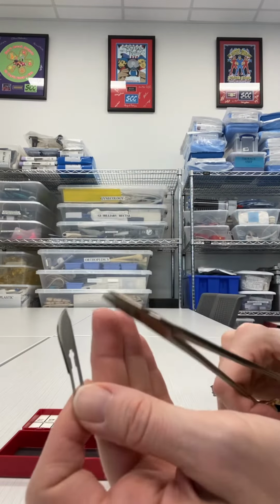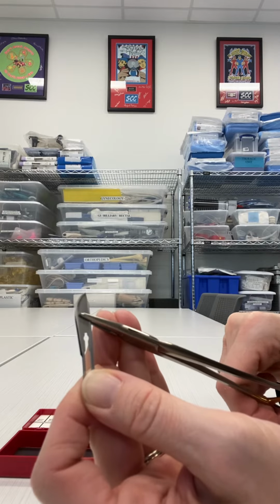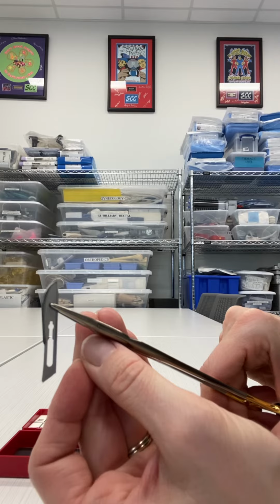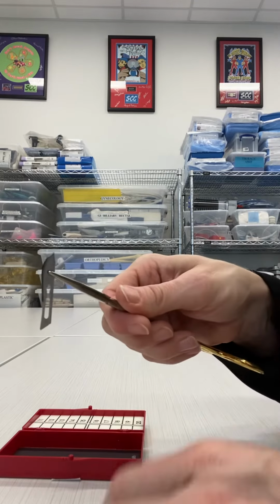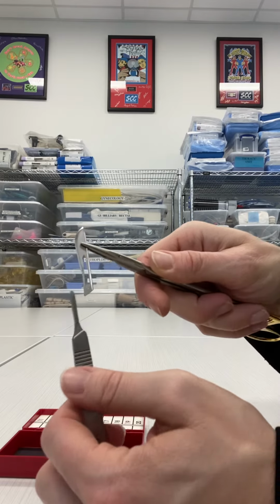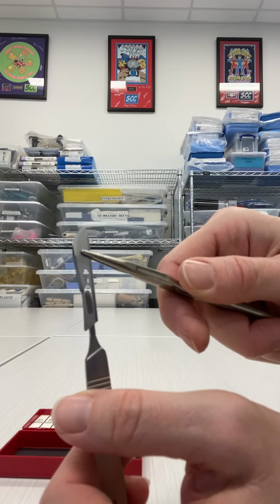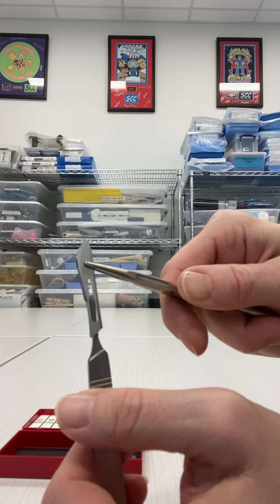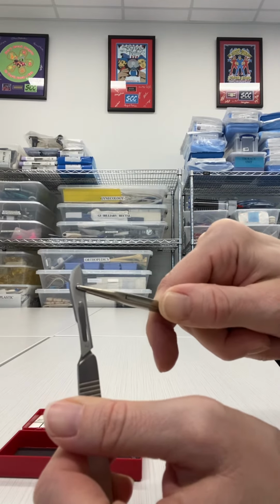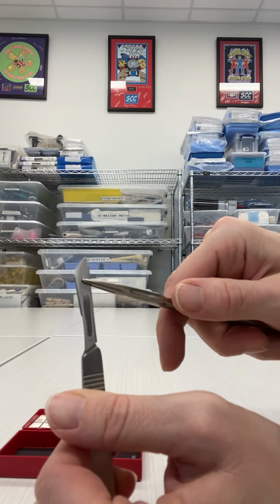I am going to load my needle holder at approximately a 45 degree angle down opposite the cutting edge. I do not want to clamp on the cutting edge. I then am going to load the blade. The blade goes on the front, the handle goes on the back. So what I'm going to do is slide that handle in from the backside in that section of the blade where it gets small, and then slide it the rest of the way on until I hear a click.